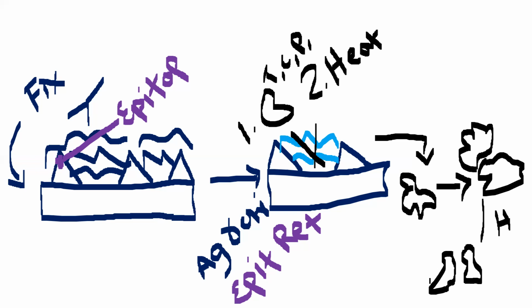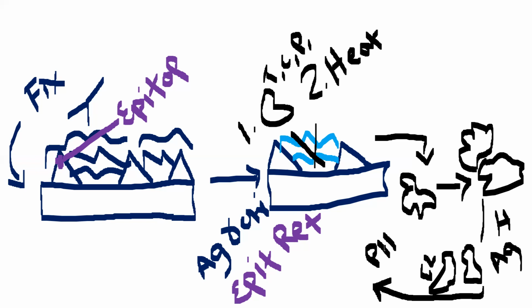These are the crosslinks, and we got the antigen, but this antigen is not in the right shape. Now, this antigen can be brought back to the right shape by adjusting the pH. By adjusting the pH of this tissue, these antigens will get their original shape. The proteins will get their original shape. So this is how the heat inducing technique works.